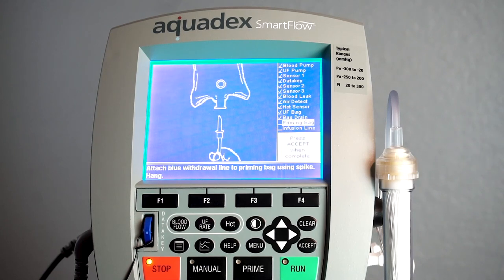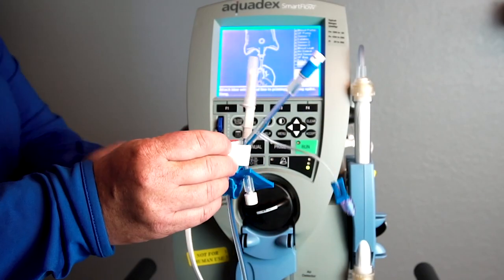Attach the blue withdrawal line to the priming bag using the spike provided in the blood circuit set. Then hang the bag.